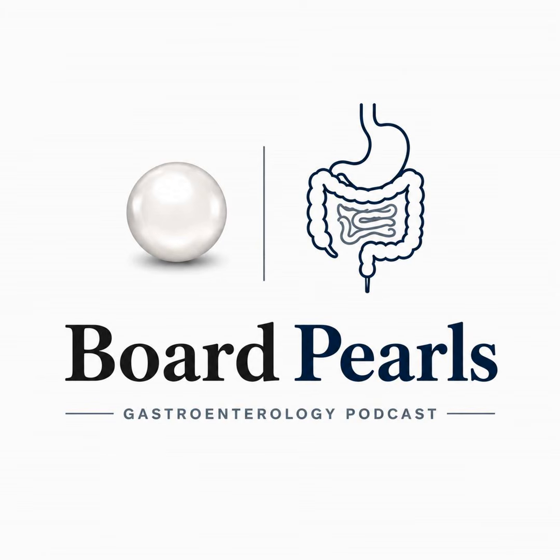Take the classic case. A hypoechoic homogeneous mass arising from layer 4, the muscularis propria. That is the textbook gastrointestinal stromal tumor, the GIST. It is dark because it is cellular and uniform, and it sits in the 4th layer because that is where the interstitial cells of Cajal that give rise to it actually reside. Location is the diagnosis until proven otherwise.